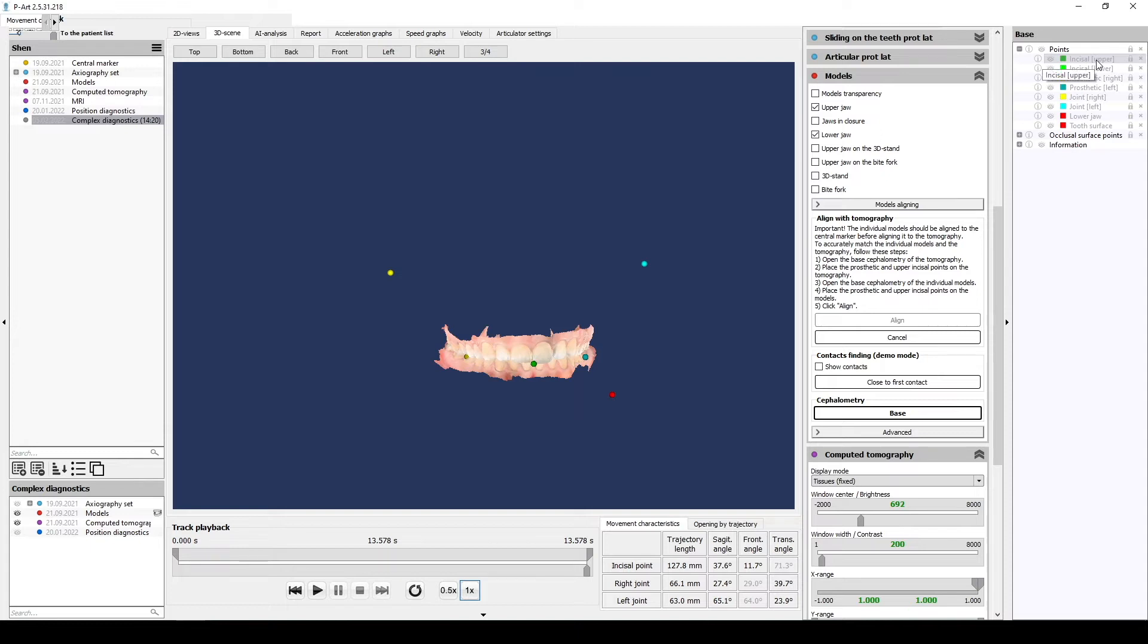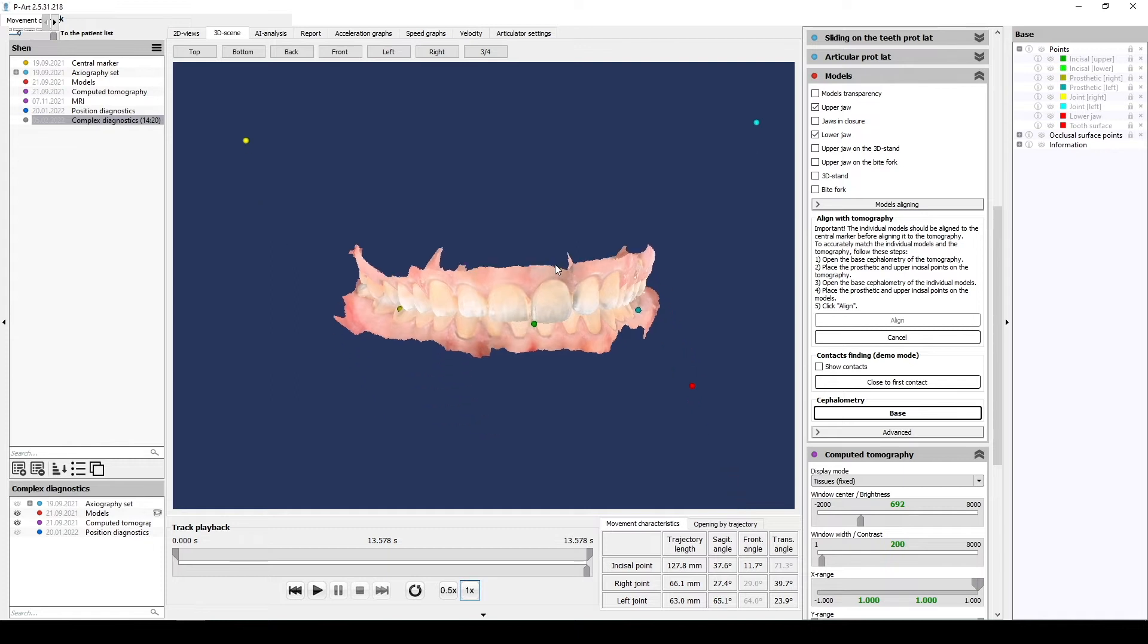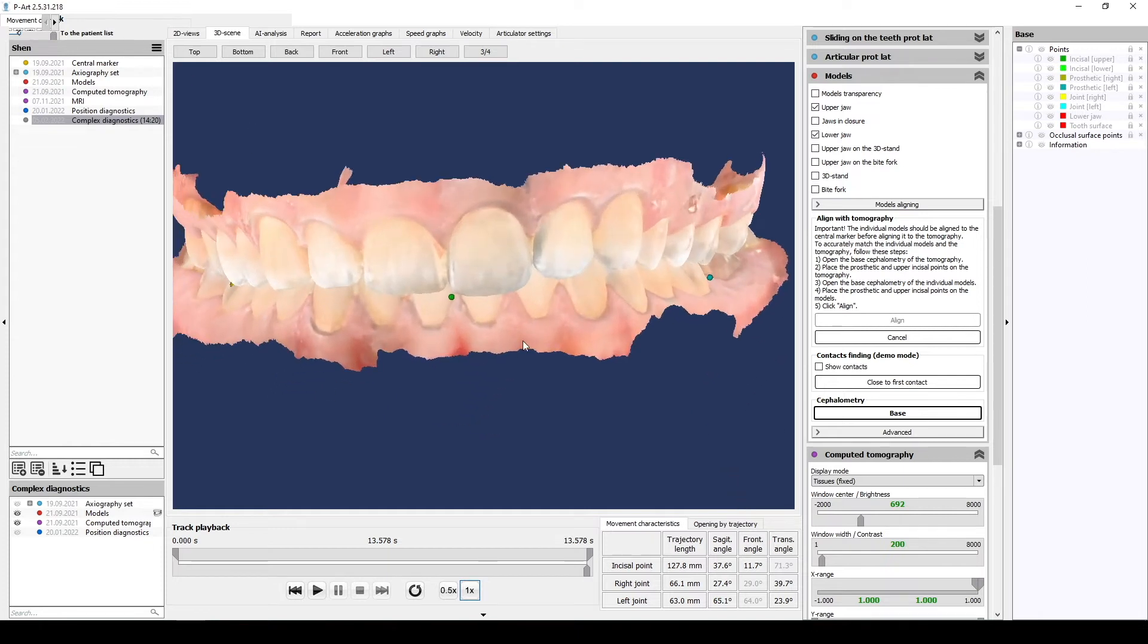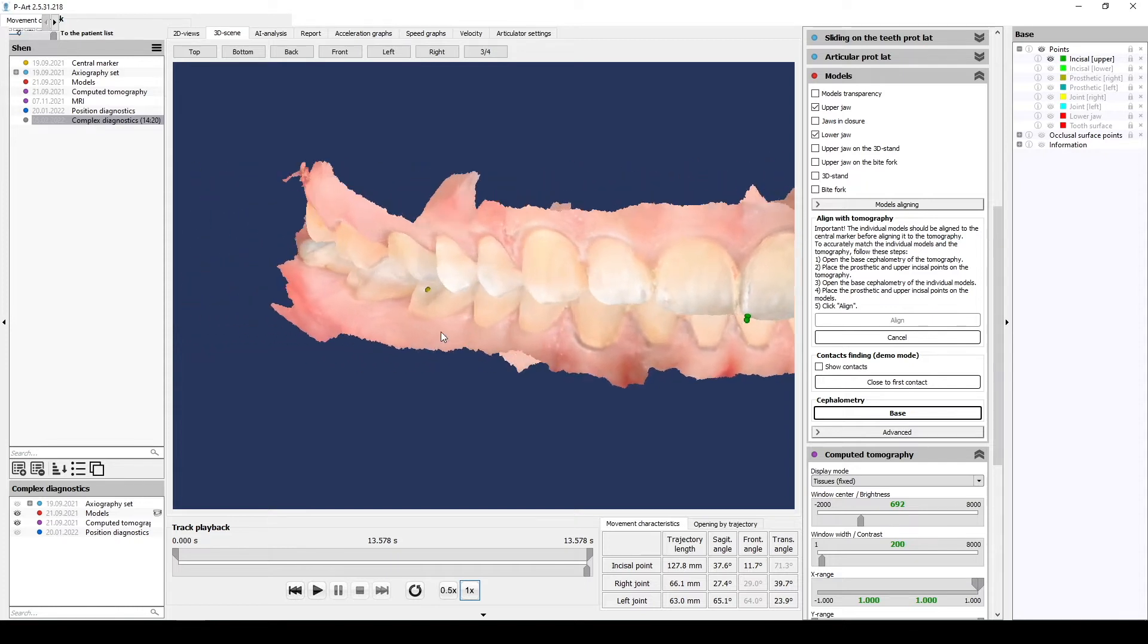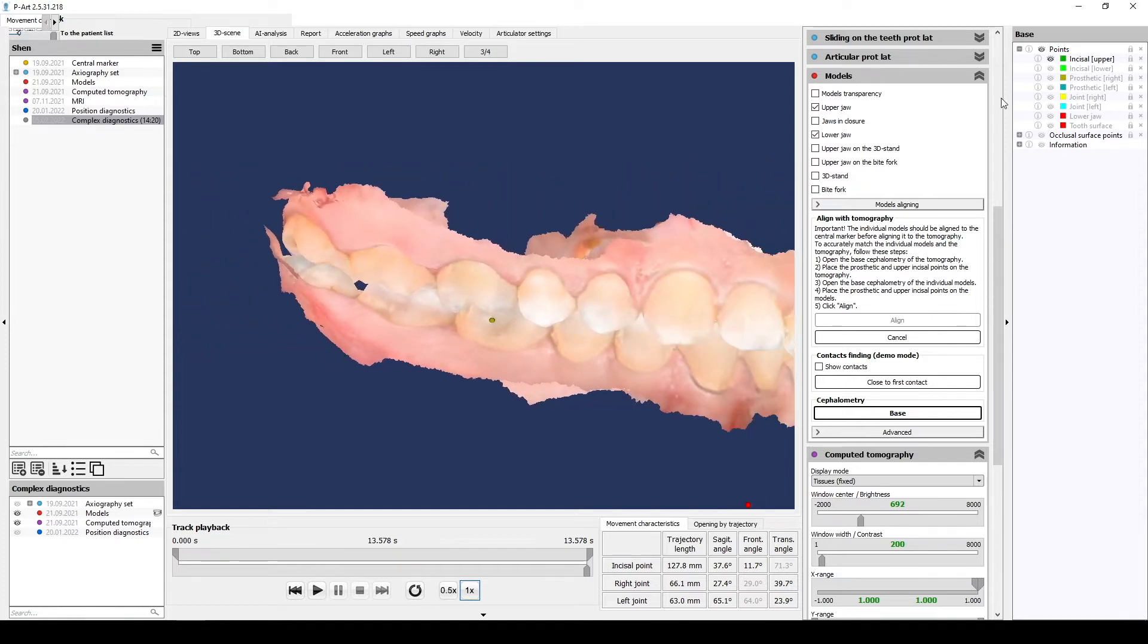Now we need to place the same three points. The points you see now on the screen are placed on the hidden CT scan. So, we place upper incisal point, right prosthetic point on the buccal cusp, and the left one.